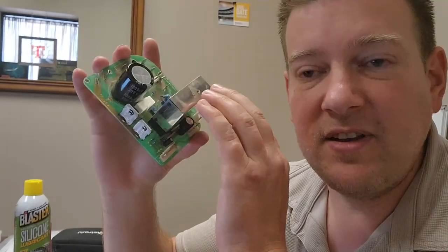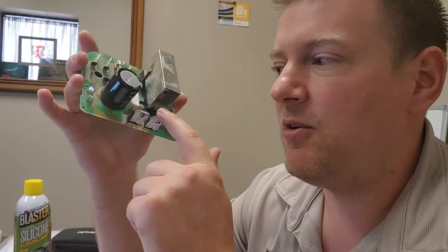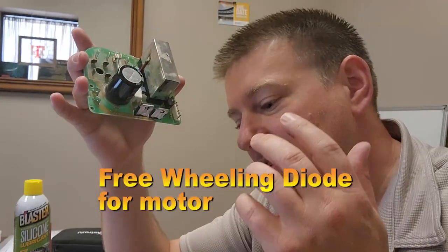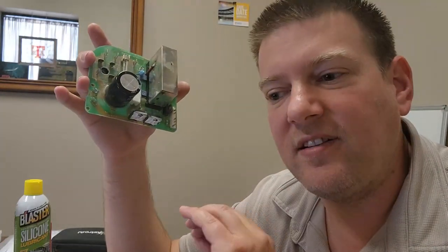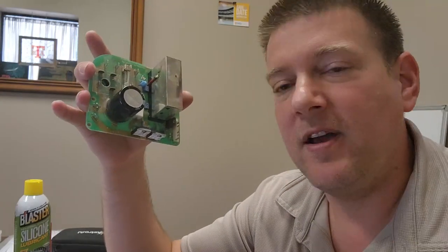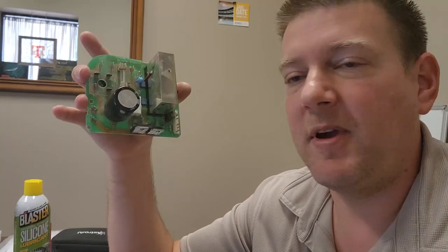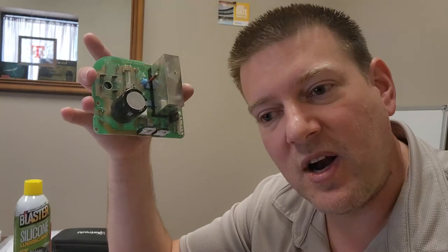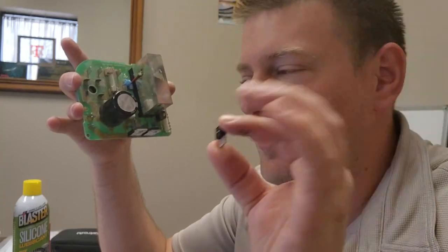So after I desoldered that, I did a physical inspection. It looked like it was fine. I soldered it back in. Now I removed the 2 SCRs and my rectifying diode right here. So I pulled them all out. I checked these guys out. They had exactly the same readings. So I knew that those guys were absolutely fine. No shorted pins. So that's how you test semiconductors, is you test for a short, and they tested fine. There was a voltage drop across them. I knew that those were working, which led me to this little guy.